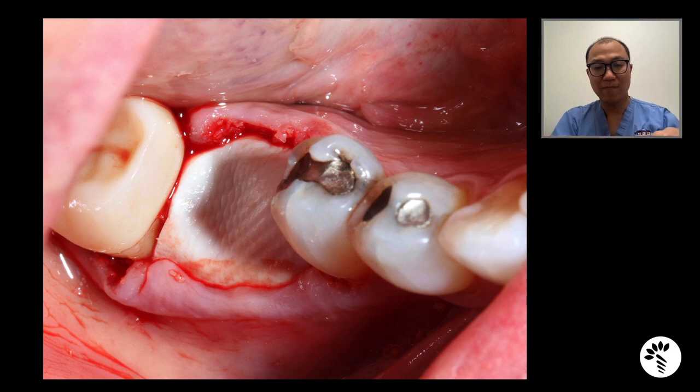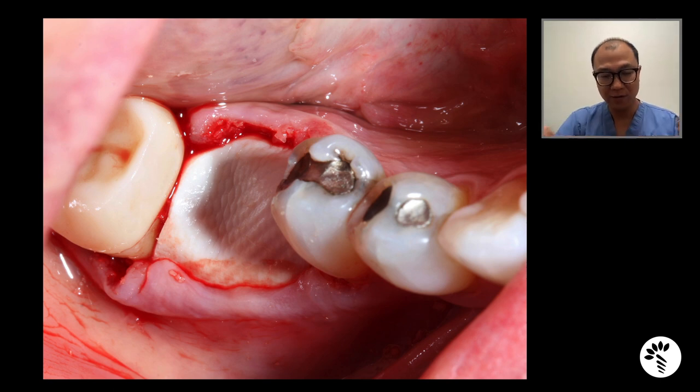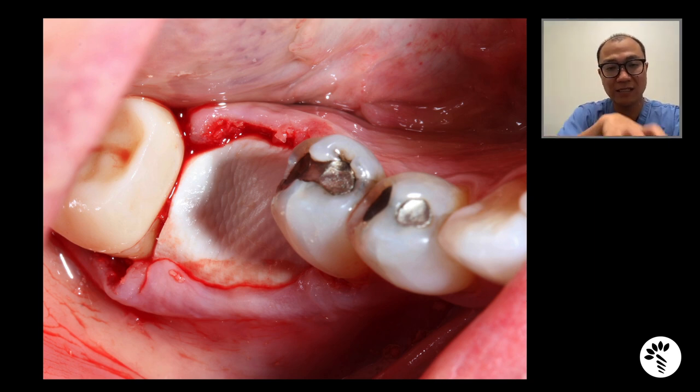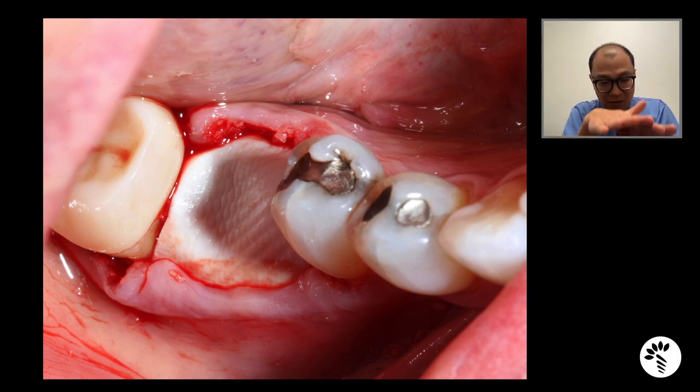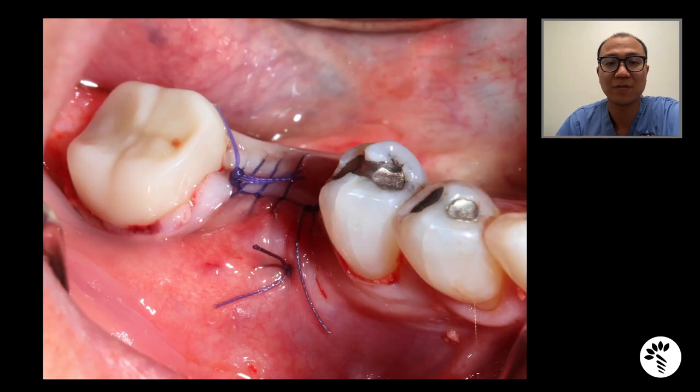Once I tuck in this membrane, I put a series of sutures in layers. One being a horizontal mattress suture starting from the buccal aspect, going over the membrane and then coming out through the lingual, then coming back from lingual to buccal and tying the knot on the buccal. When you do that, the flap is going to be coronally advanced. After that, I use continuous sutures on the crest with a little bit of twisted interlock so that I can bring the flaps together. And if necessary, I may augment this crestal aspect with single interrupted sutures. In this case, I did not need single interrupted sutures. I was able to get primary closure by putting a horizontal mattress suture from the buccal aspect and a crestal continuous interlock suture using 4-0 Vicryl. You can clearly see that primary closure has been achieved.